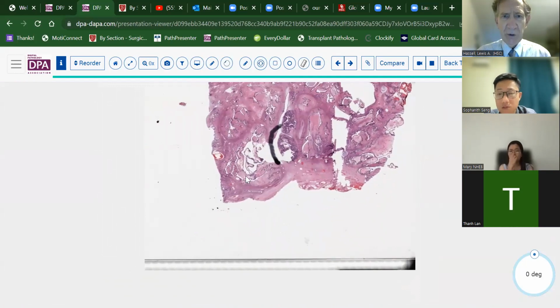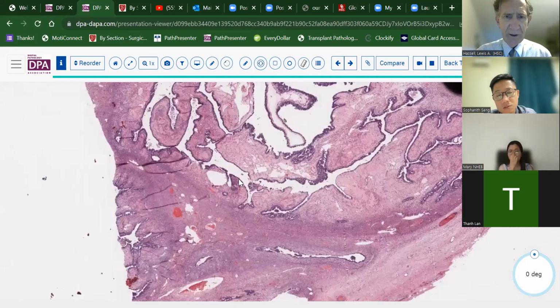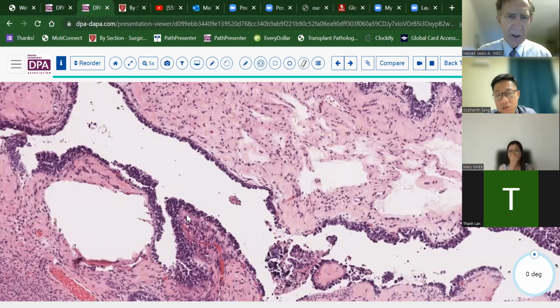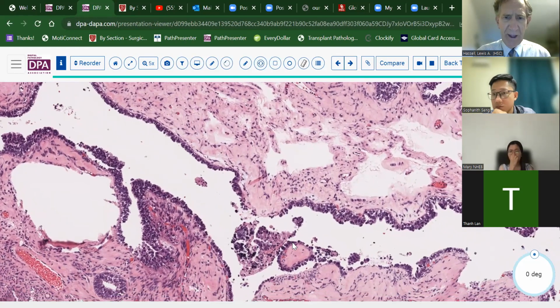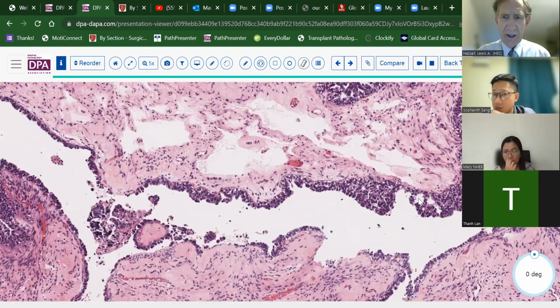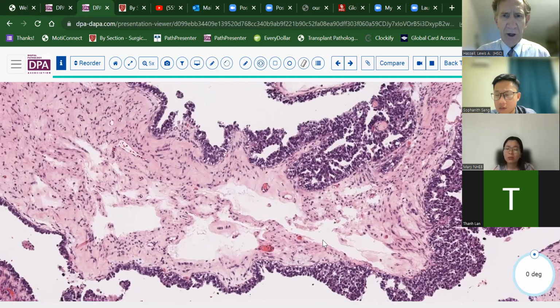So for me, this was a great learning case to see that not everything that might be considered higher grade nuclei is going to be high grade serous carcinoma when it's WT1 positive. And so keeping in mind this cribriform variant, which can look a little bit like these arcades as you see here, would help us. Now, in theory, the P53 should have helped me here.